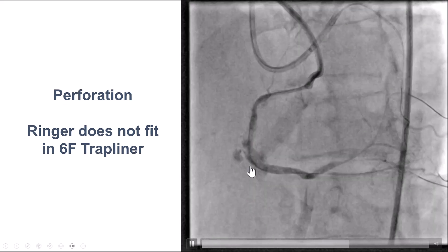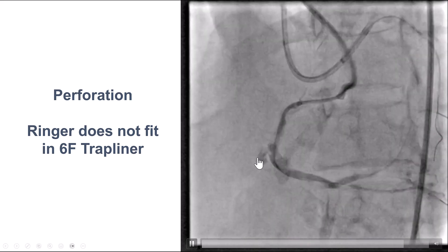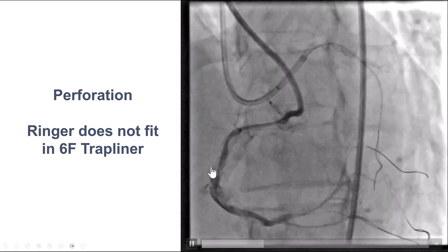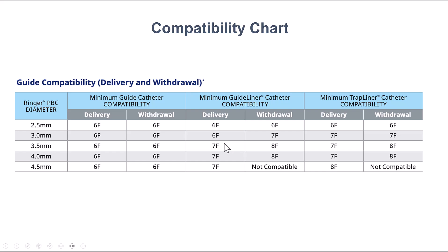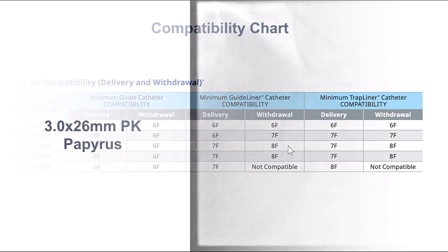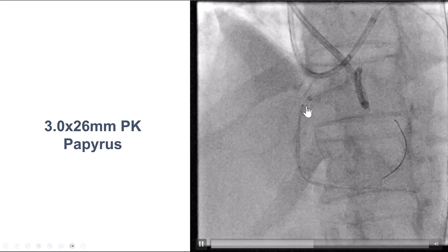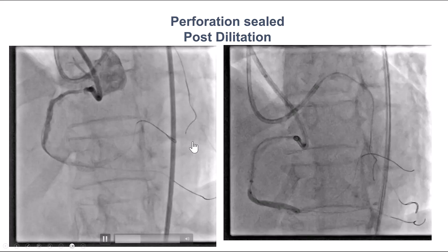We then placed two drug-eluting stents, but unfortunately we encountered a mid-right coronary artery perforation, likely related to the heavy calcification. We thought it was not a very large perforation and potentially could use a prolonged balloon inflation with a ringer balloon. However, we had a 6 French GuideLiner and could not deliver it — it turns out that to deliver a 3.5 mm ringer balloon through a GuideLiner catheter, you need at least a 7 French guide extension. What we did eventually was deliver a PK Papyrus through the GuideLiner. It was a little tricky, but having a second guide wire helped, and we were able to get it down the RCA and deploy it, which successfully sealed the perforation.